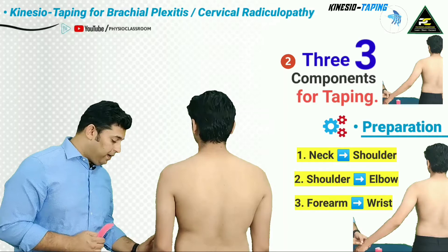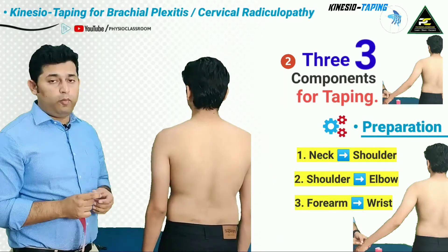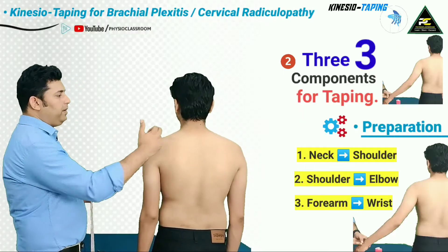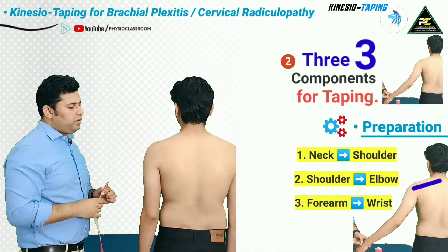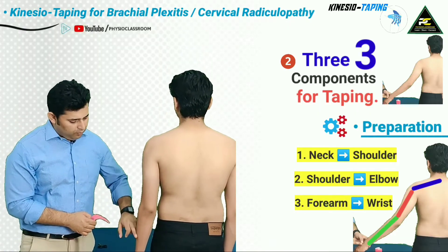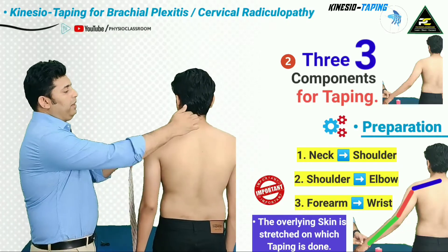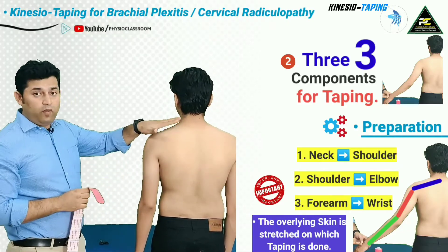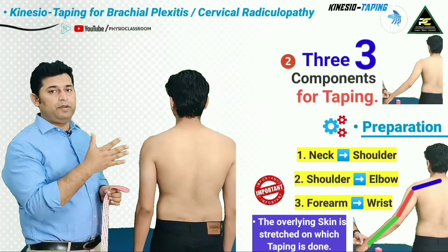For this patient, in whom the pain is running down up to the wrist joint, there are going to be three components for taping. The first component will be from the cervical spine up to the shoulder joint, the second from the shoulder joint up to the elbow, and the third from the elbow up to the wrist. Ensure that for every component, the overlying skin needs to be put on stretch before the tape application.